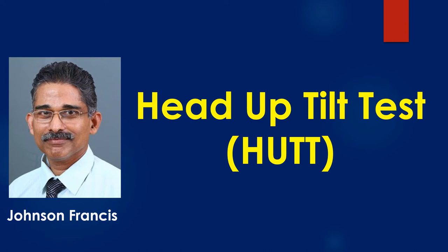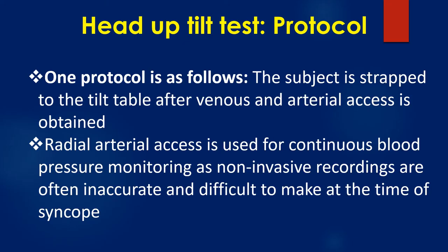Head-up tilt test, known as HUTT or tilt table test, is commonly done for the evaluation of neurocardiogenic syncope, for example vasovagal syncope. Various protocols are followed in different centers. One protocol is as follows.